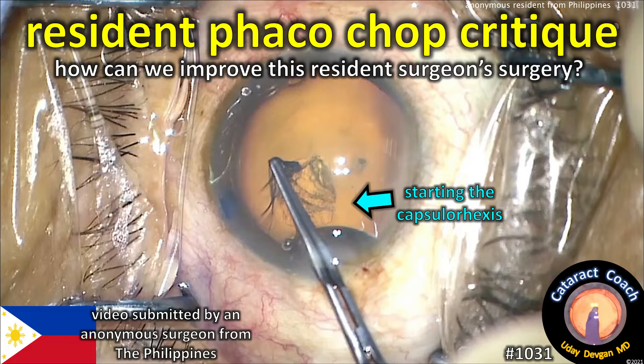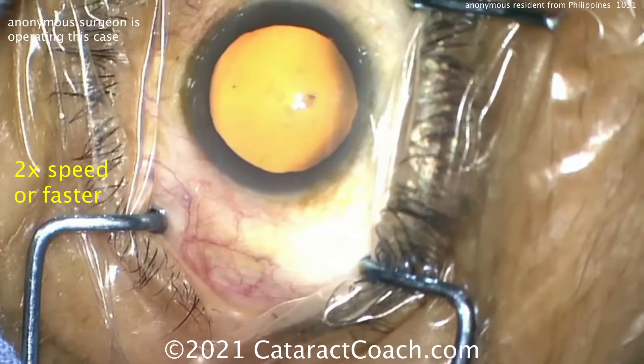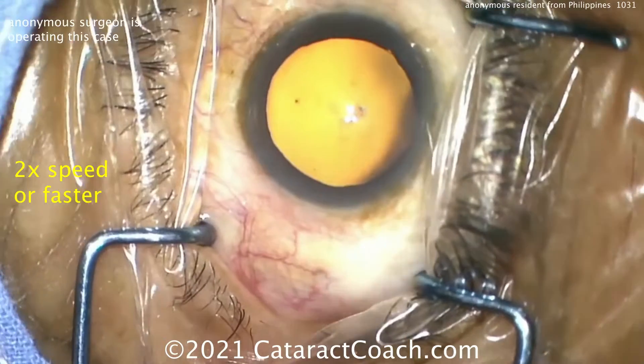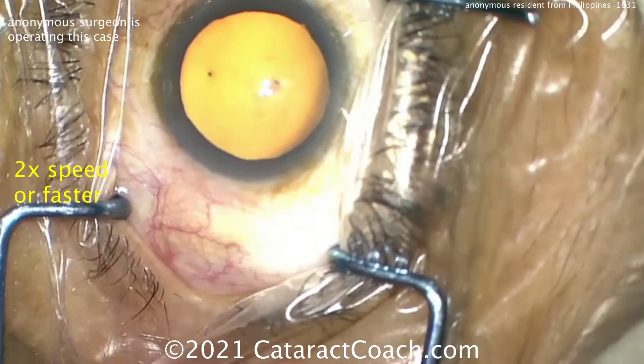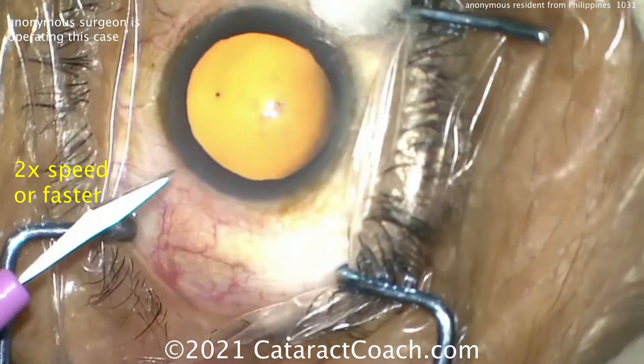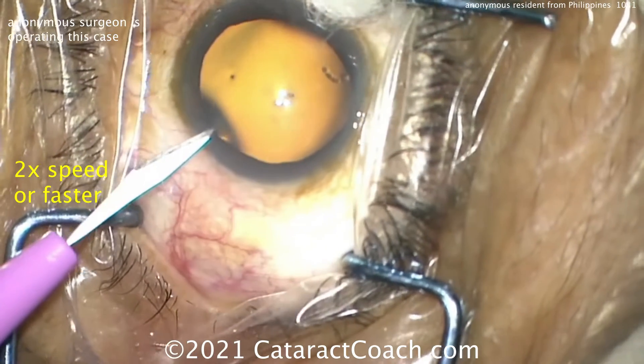CataractCoach.com resident phaco chop critique — how can we help this resident? We have an anonymous surgeon from the Philippines. We'd like to see videos from these young doctors in training; it shows they're really taking pride in their work. Let's start off by looking at the draping — nice draping, lashes out of the way, lid margins sequestered.